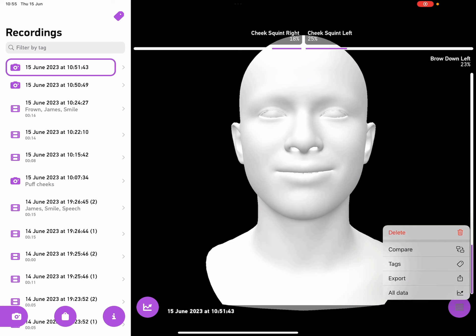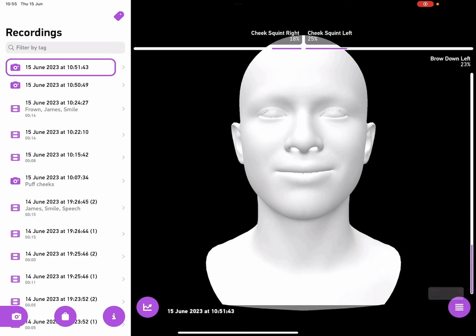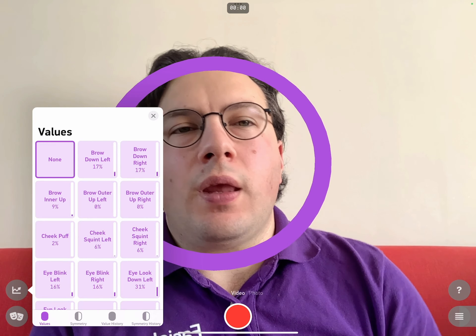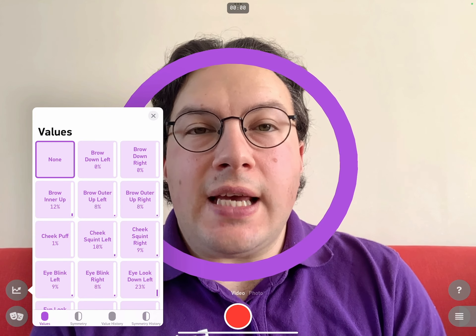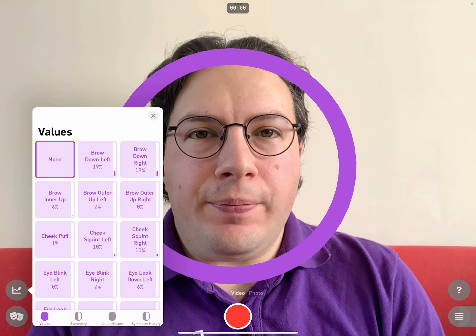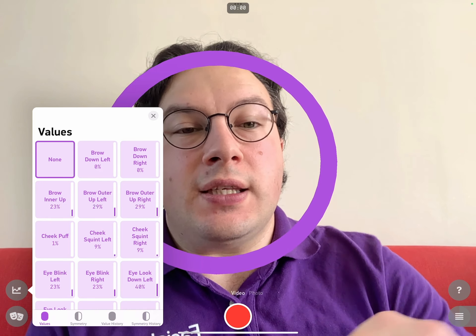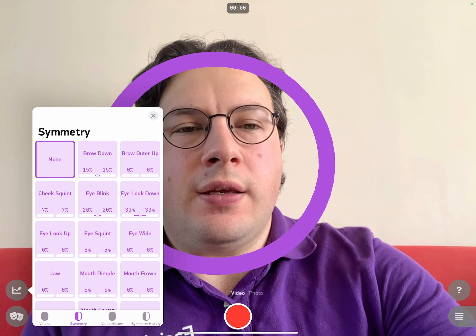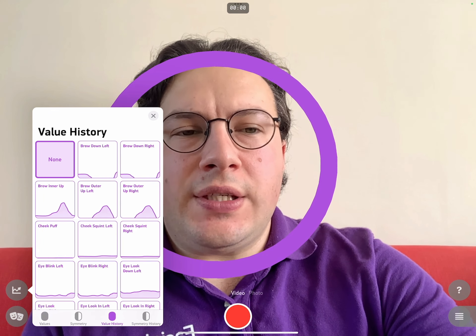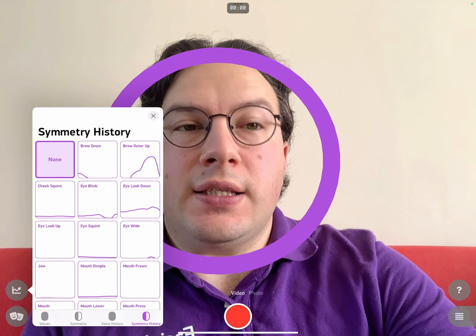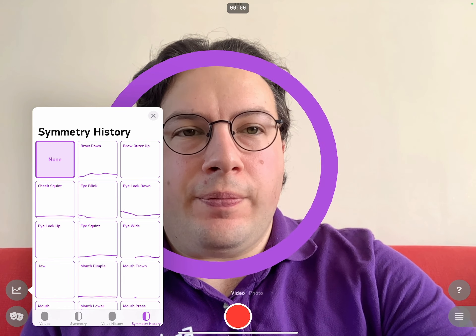Let's go back to the camera again. There's a couple of other features of the app that I'd like to show you. The first is a live preview of the values that we're recording. If I tap on this button here, I can see the same graphs that I did in the replay. And I can see the symmetry, I can see a value history, and I can see the symmetry history.